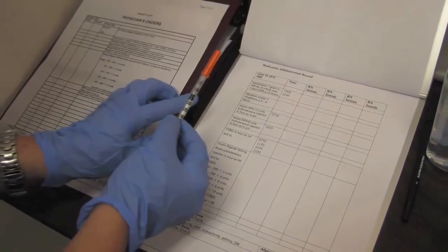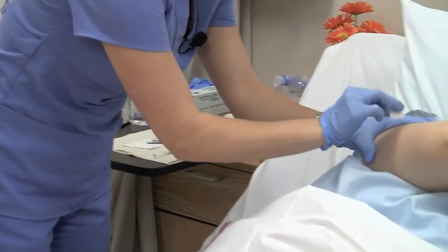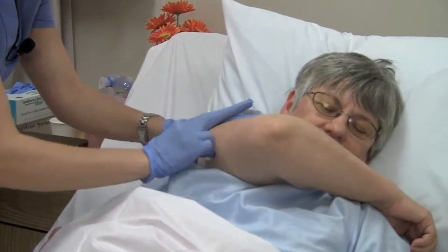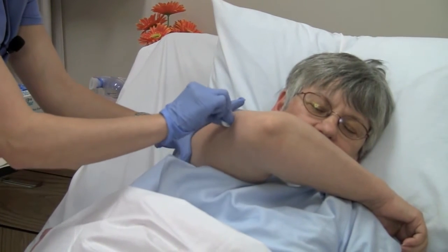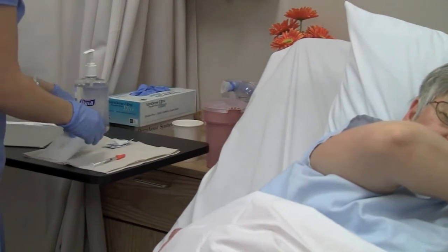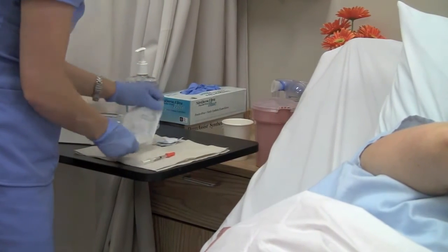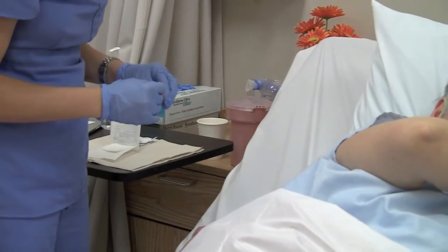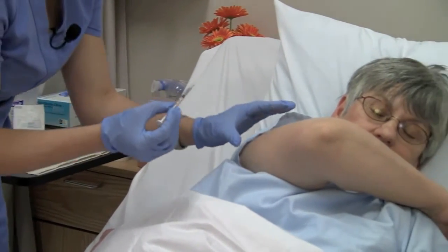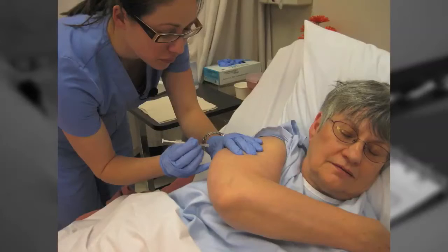Compare the MAR to the medication to be given. Wipe the injection site with an alcohol swab and let the skin dry. We'll let that alcohol dry and I'll give you your injection in just a moment. Alma, take a nice deep breath. Pinch the skin and insert the needle into the skin at an 80 to 90 degree angle and inject.